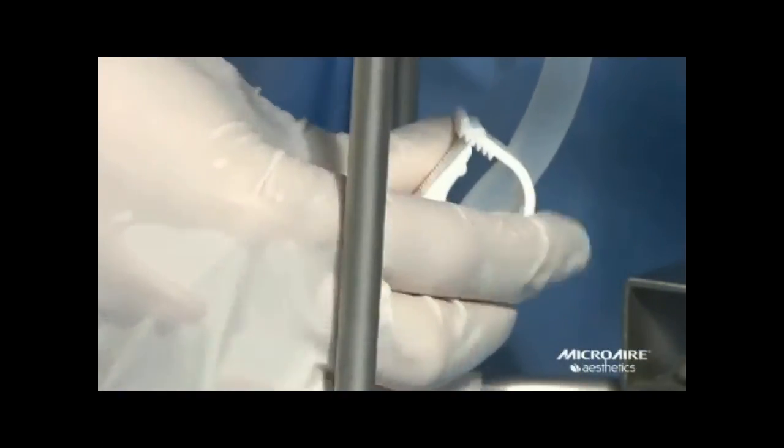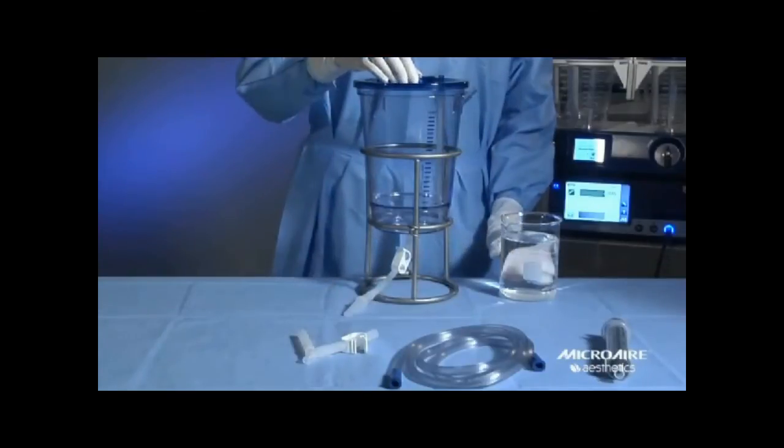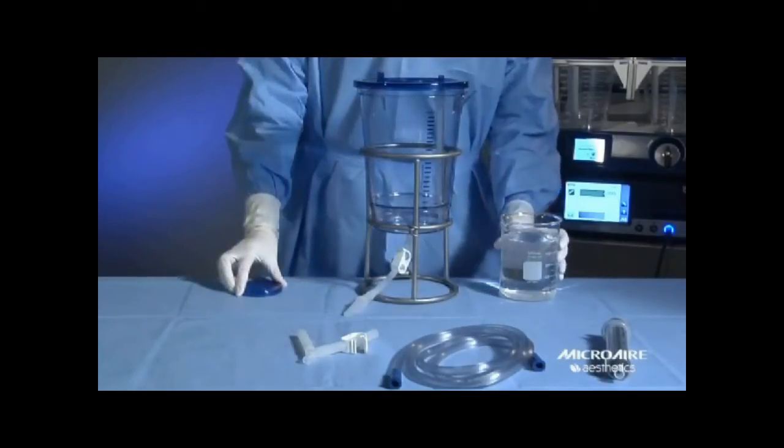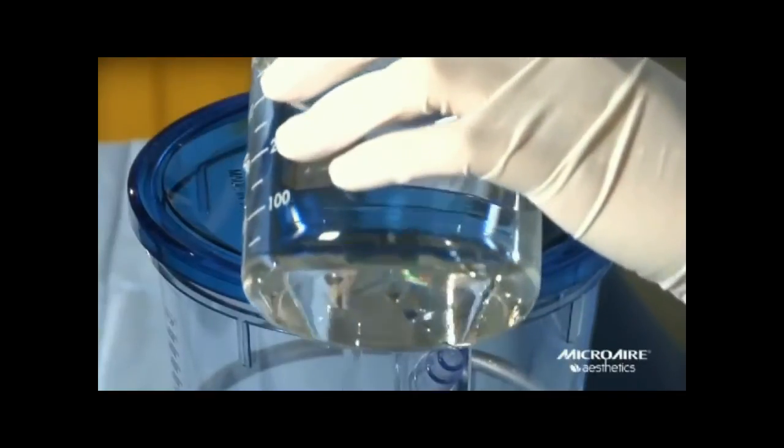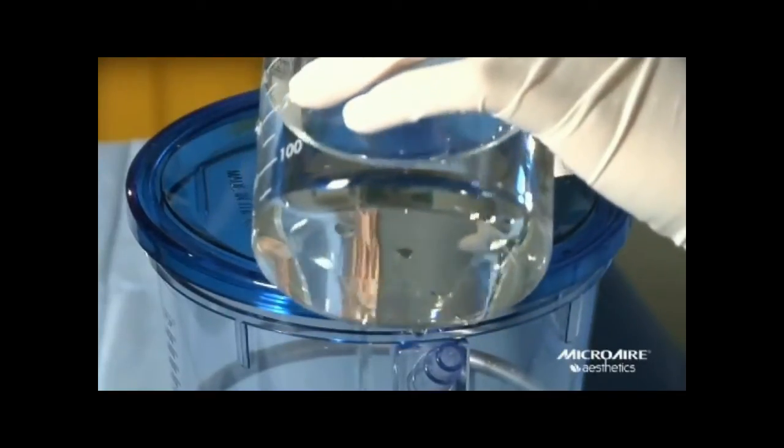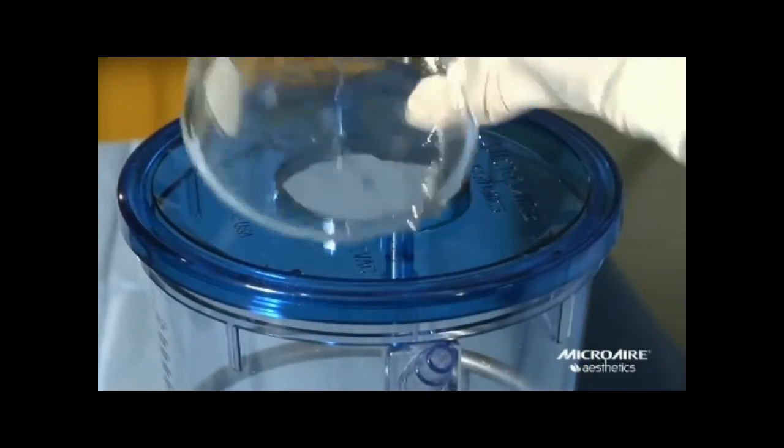Preload the canister with a minimum of 500 cc's of sterile saline or lactated ringers. We recommend 700 to 800 but never less than 500 cc's. This cushions the fat coming in and gives it a nice wash. Do not use sterile water as this will damage your fat cells.